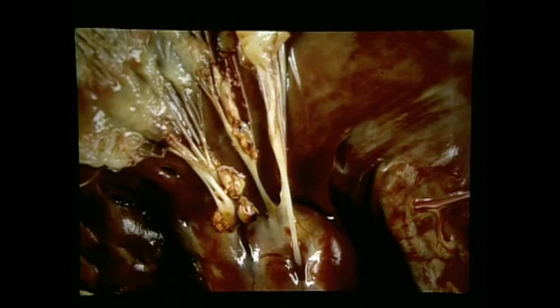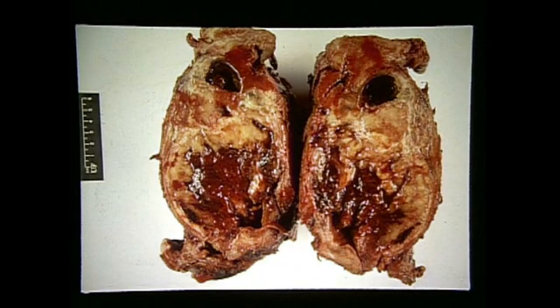Likewise, aspects of the chordae tendineae had these small nodules which turned out to be neoplastic mast cells. A case of schwannoma arising from nerves associated with a hind leg, characterized by spindeloid cells again, that's been positive for markers belonging to Schwann cells.